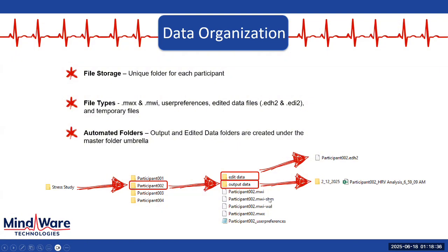These other files that you see here, I do want to show because they are temporary files. When we load an MWI, if you return to the folder that you're loading the data from, you'll see these SHM and WAL files. These are just temporary files that are only opened when we're actively loading an analysis session, and they should disappear as soon as we close that out. If, let's say, something crashes within your PC or the Windows application, Explorer, what have you, these files may remain afterwards, and in those cases you can delete them. They really have no effect on everything.